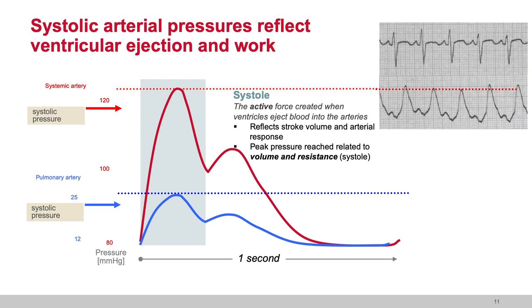So as we look more closely at that beautiful component of systolic pressure, here on your cartoon representing the systolic pressure of 120 for the artery and of 25 for the pulmonary artery, reminding ourselves of the way this looks on a printout waveform over to the right, where you are seeing the correlation of the above level, the EKG, the QRS, correlated to the systolic upstroke which follows it. We all know you must have electrical to have mechanical. You can have electrical without mechanical. You can never have mechanical without electrical.